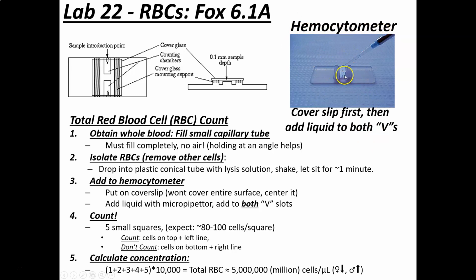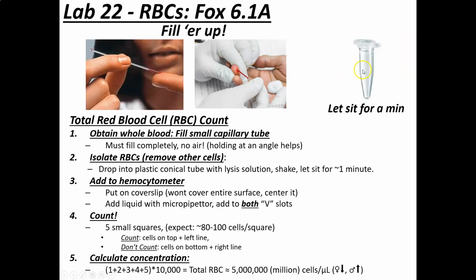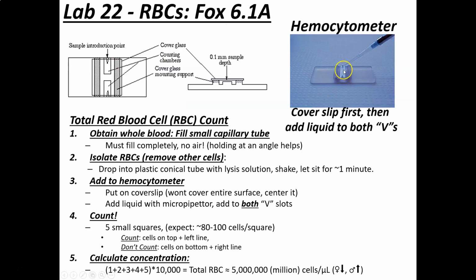They look like this. They have a little mirror. This picture is not very good, because there should be a cover slip on top of this. They have these special glass cover slips that allow us to use the capillary action of the solution that we made with the blood in the centrifuge tube that we saw in the previous slide. So we made it by taking the blood, putting the tube in here so we have the exact amount, letting it do its thing for a few minutes, and then putting it on the slide.